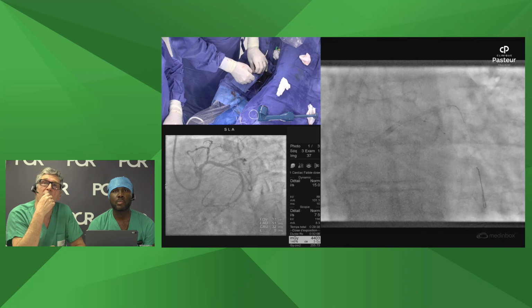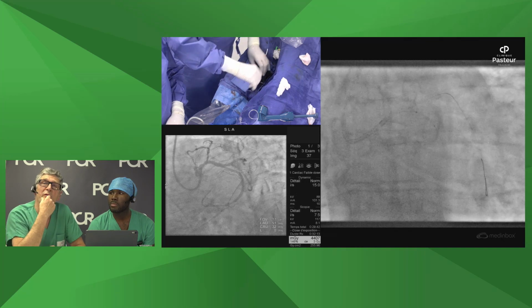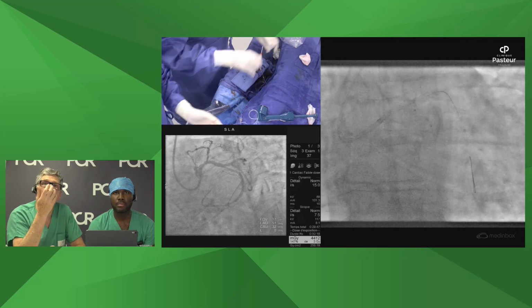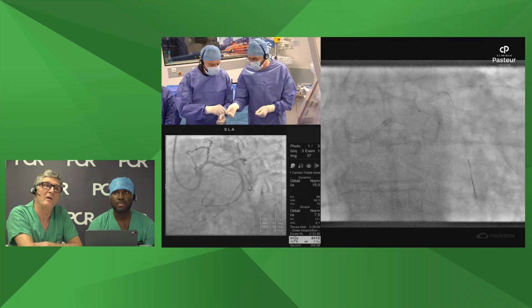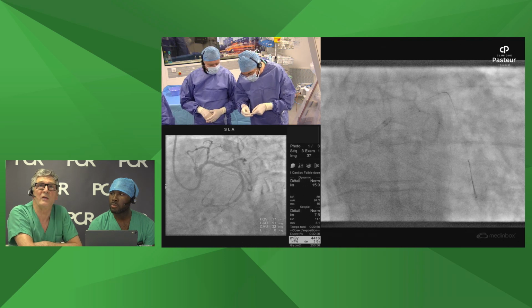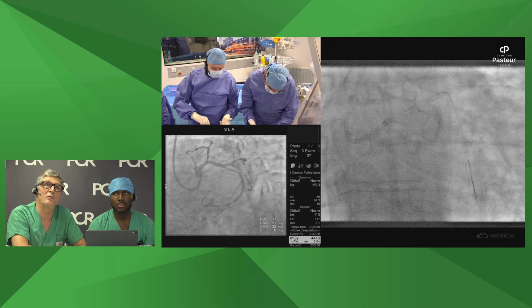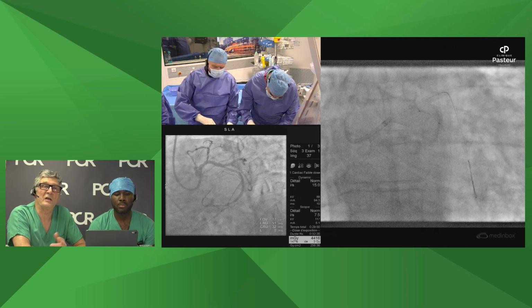The other thing is rheology. We know that when we leave a strut unopened in a bifurcation, the rheology is not optimal. So we have areas of low shear stress opposite to the circ, which may promote neoatherosclerosis in the LAD or in the left main. So for all these reasons, I prefer to open it. But of course, we have no randomized study showing that it's better to do that. So I see that you are happy to do it also, Jean.